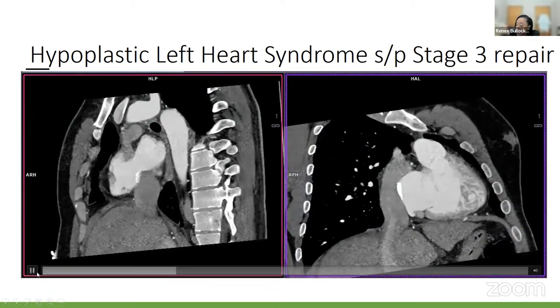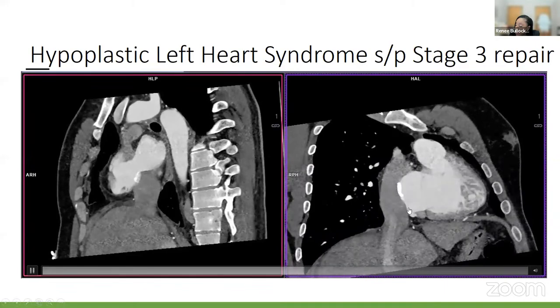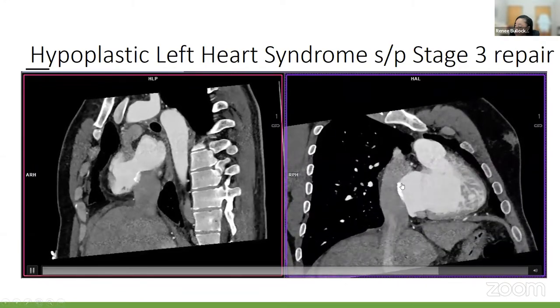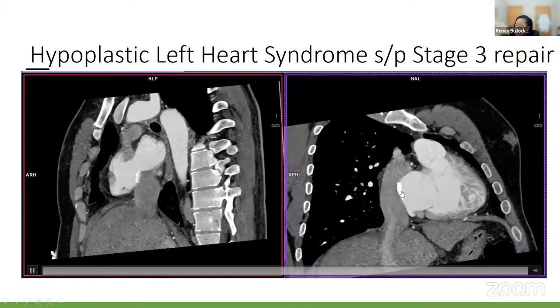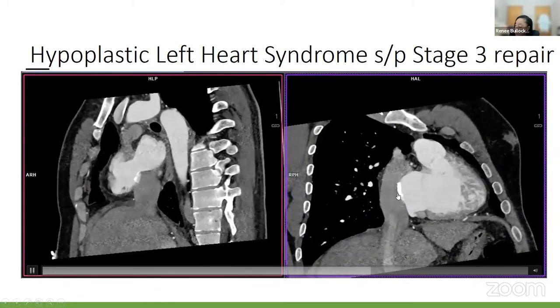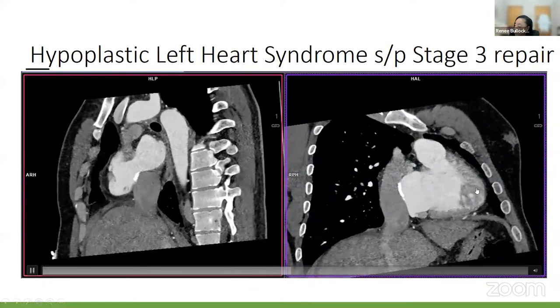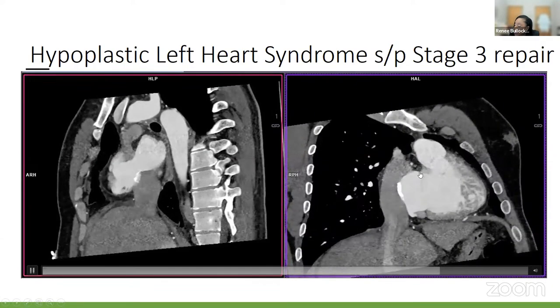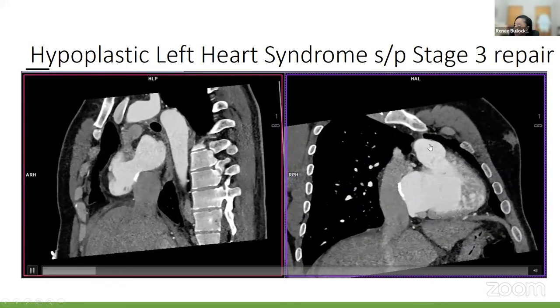In another view, the right and left atria serve as one large atrial conduit. This patient had a non-fenestrated Fontan — the Fontan flow and atrial flow are separate, with closure present. Sometimes the Fontan must be fenestrated when there is high right-sided pressure, serving as a pop-off valve, though the risk is stroke if clot is present in the Fontan and fenestration allows it to cross. In this patient the Fontan was not fenestrated and no blood flow is seen from the Fontan into the left atrium. The RV is large and dilated, serving as the systemic ventricle with systolic dysfunction. The tricuspid valve serves as the systemic atrioventricular valve, with blood flowing into the reconstructed aorta.